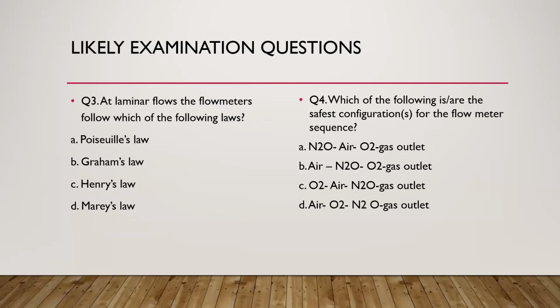All right, question 3. At laminar flows, the flow meters follow which of the following laws? Bernoulli's principle? That's not Bernoulli. All we have is Poiseuille's law. Somebody is answering a question that is not there. Poiseuille's law, A. A is correct.